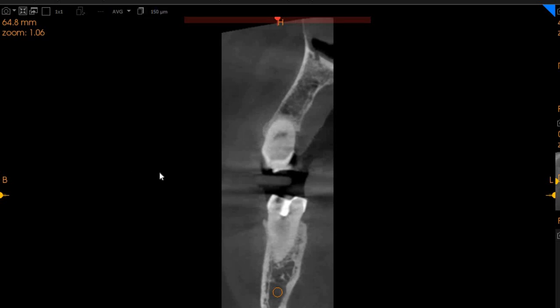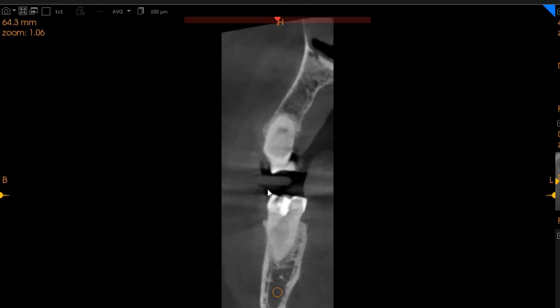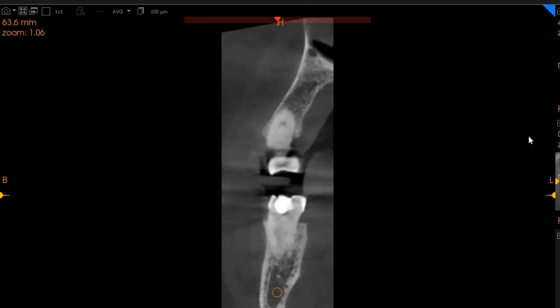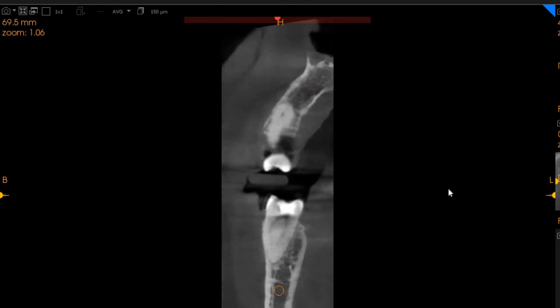On the transaxial view, you can very clearly see we've got the distal canal — a very sclerosed canal. In the distal, we've got two canals joining to form one at the apex. This is the distal canal. And then we've got the mesial canal, again a very sclerosed canal — two canals which almost join at the apex.